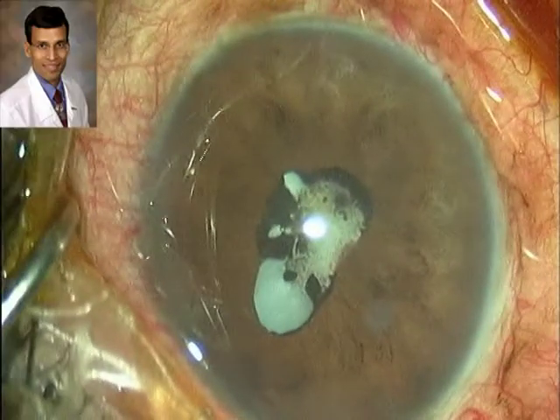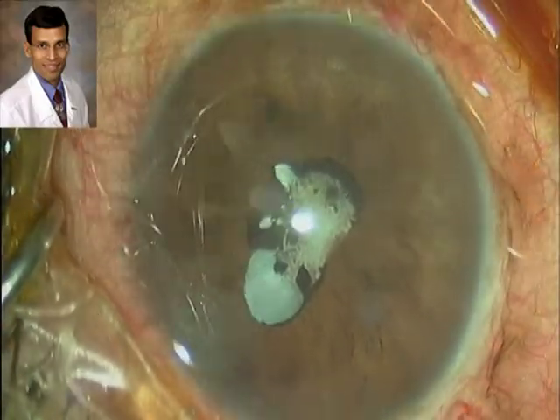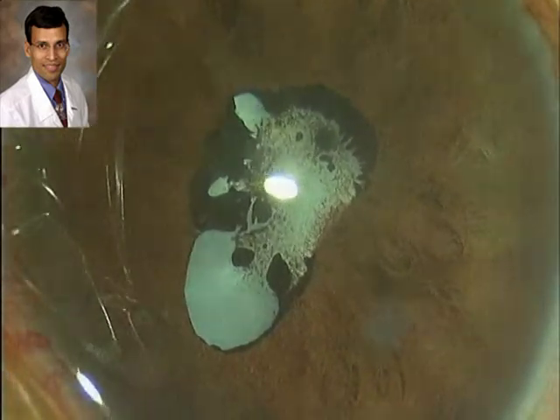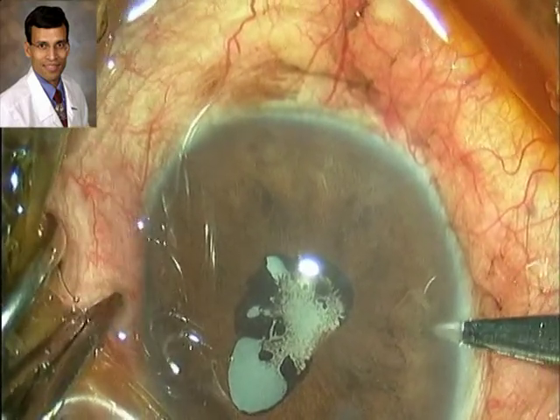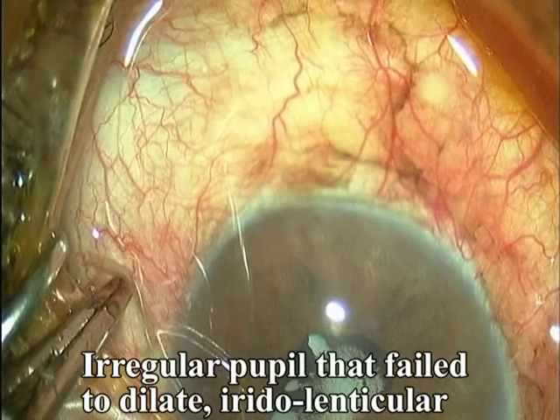Now, this is a case of a traumatic cataract which has a fairly fibrotic membranous cataract, irido-lenticular synechiae. The pupil is bound down to the capsule and the cataract is white in color. So we have to be well prepared and carefully plan these surgeries, as we may have to deal with a variety of problems in these cases.